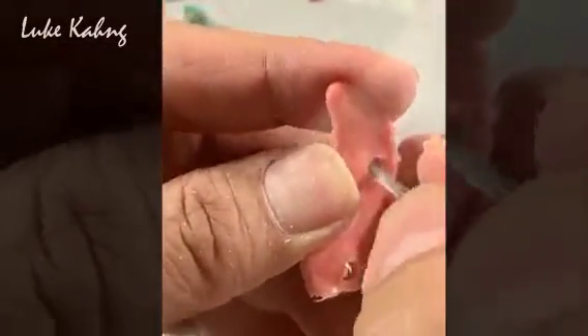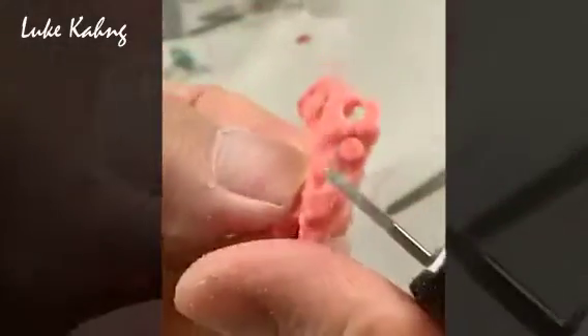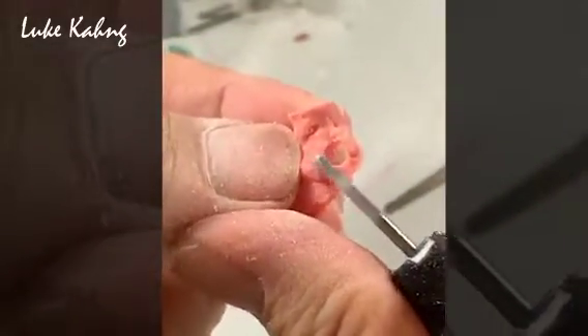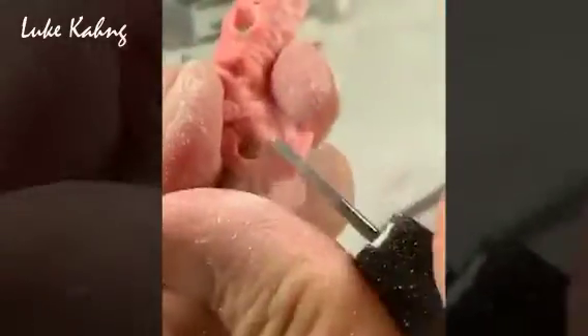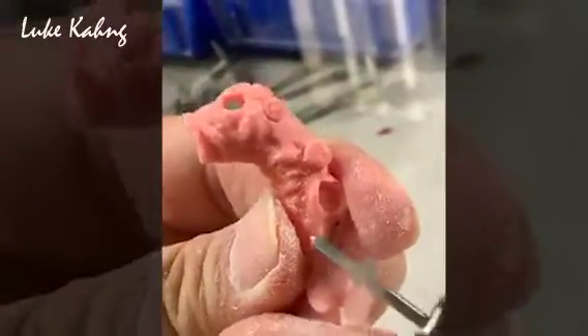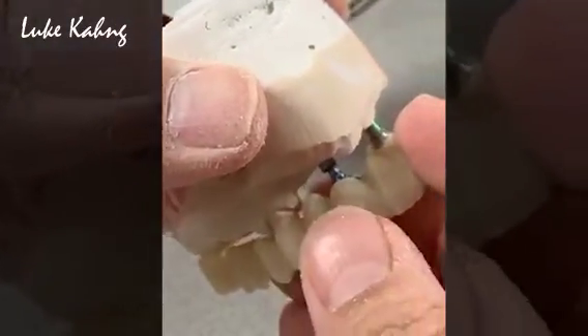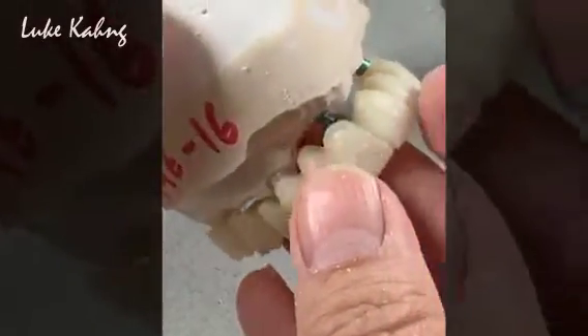We care about the long-term temporary. Here is a patient who has implants. We just grind and trim it a little bit to make better healing. I can do a little bit more later and then try to fit it — without tissue first, just to make sure it's fitting. Fitting is good. It's done one by one. I completed that one.